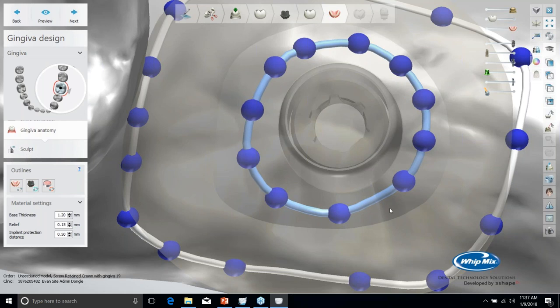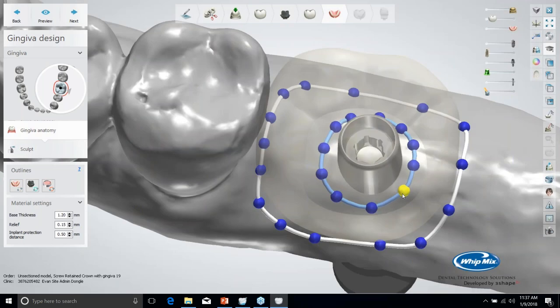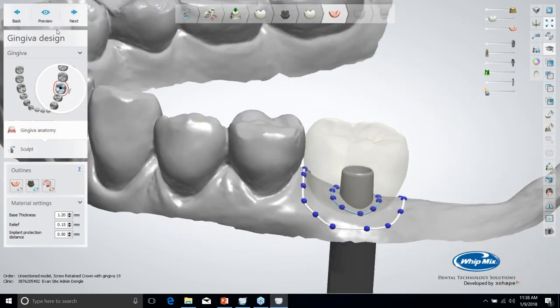Also, these lines can't be super close together, or it won't let you move forward. So like if for whatever reason the border I drew and the window I drew were really close like that, it's not going to allow it. So generally what you have to do is you can't really adjust the window because you'll make those as small as you can, but you'll have to bring the border out further and then finish it by hand.